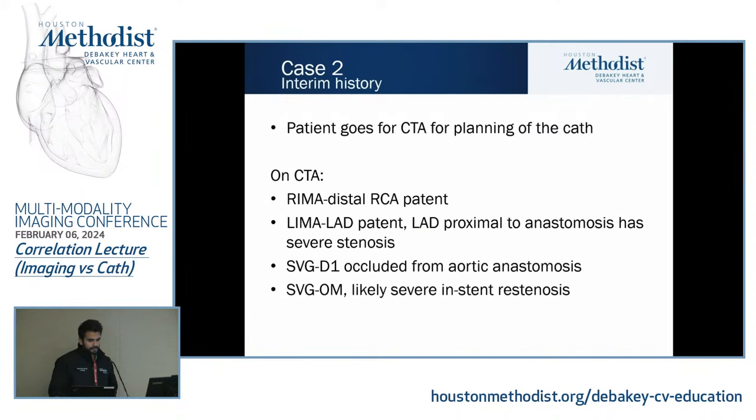Question on that. Are you using less contrast? Does CT use less contrast dose than a cath? Yes. So for this case, we would use maybe 60 cc's to 100 cc's of contrast. In a complicated CABG cath, you may go up to 200 cc's. Plus, you're fishing around.